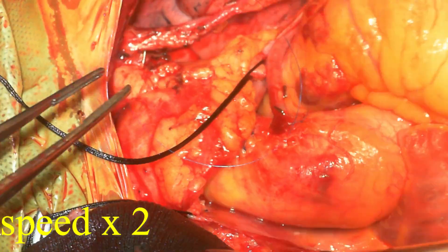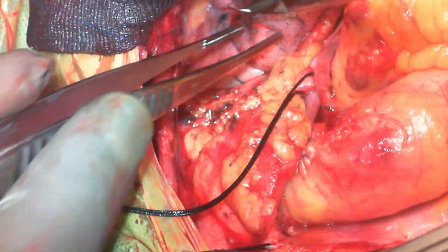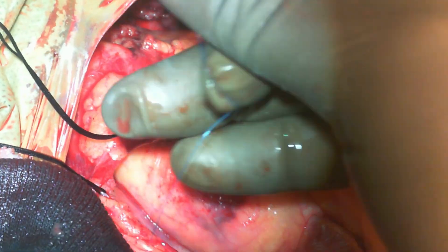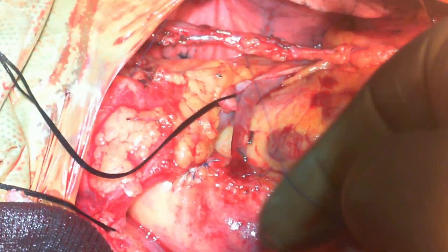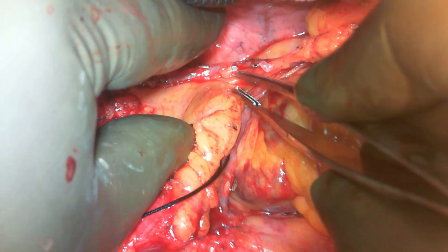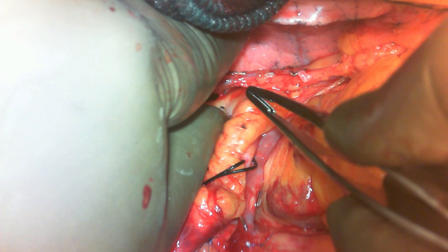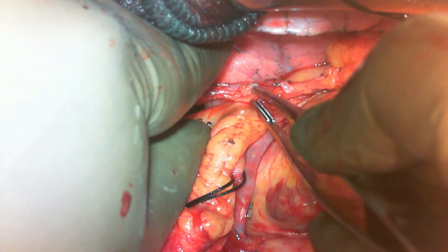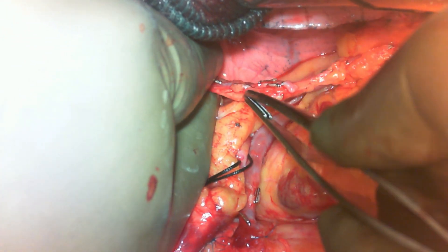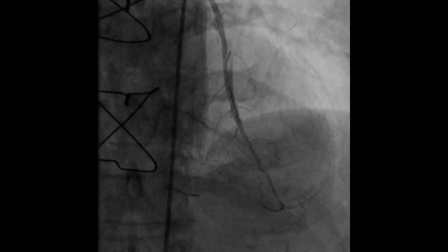I am taking big bites, so it's very unlikely for this suture to tear or for the parenchyma to tear. If that happens, there will be massive surgical emphysema, which will take time to heal. One of the problems with this technique is iatrogenic surgical emphysema. As you can see, the LIMA is lying loose, so this technique would be useful.